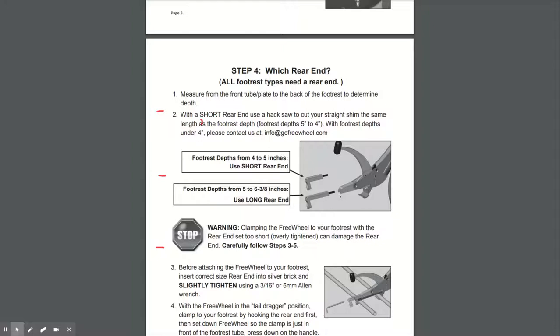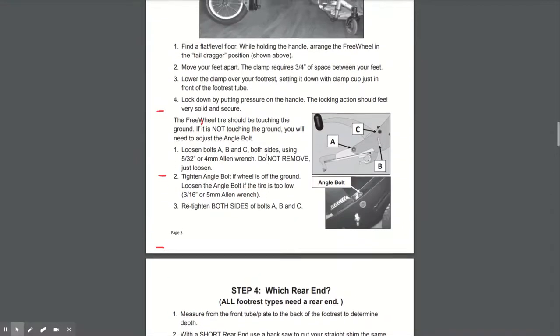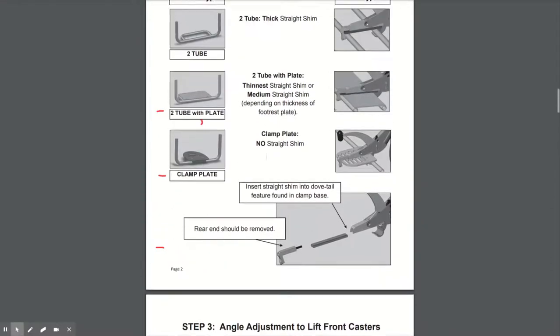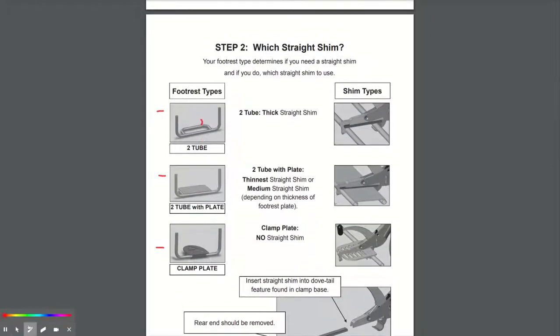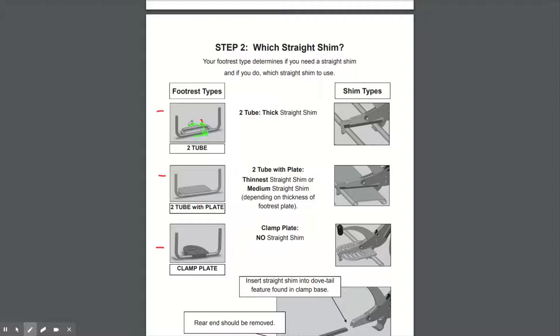And the thickness of the shims: the thin, medium and thick shim. What you then need to do is go to your footrest and measure from the back to the front of the tube. So from the outside of the tube to the outside of the tube, front and back, so the depth of your footrest.